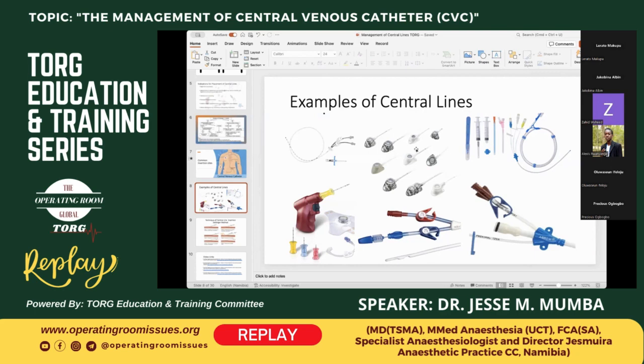The ones with chemoports under the skin can go from 6 months to a year. So these will probably be the longest. I've seen a number of patients come to theater with chemoports who are not necessarily on chemotherapy.